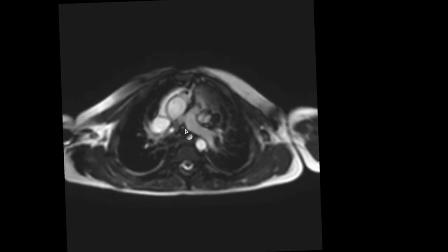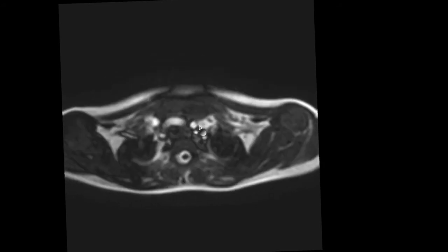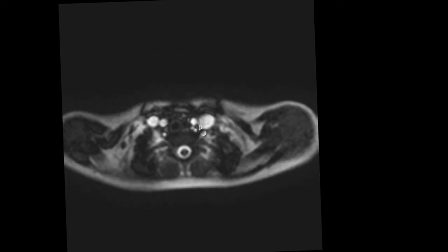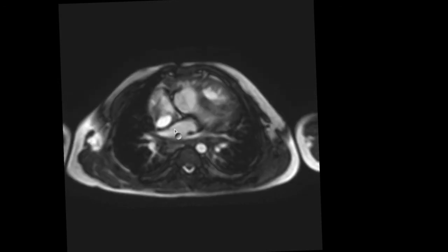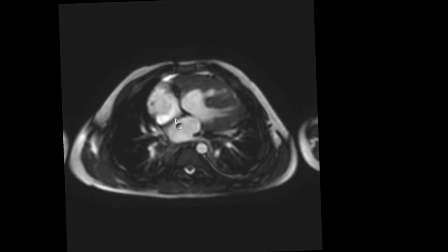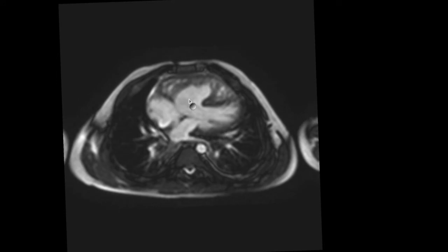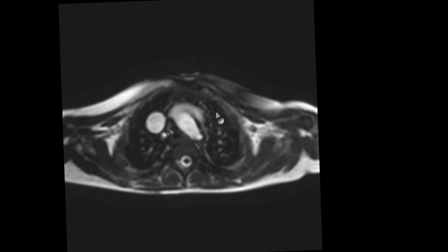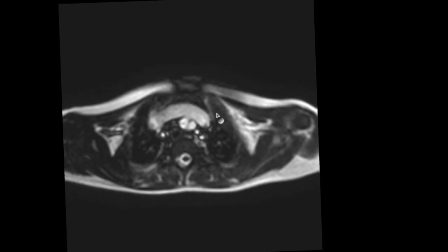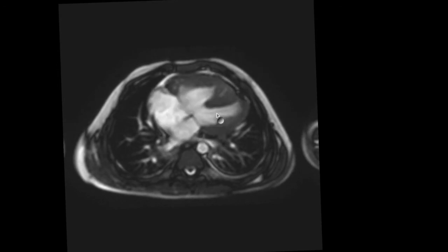Along with that, I am seeing a small vessel which is draining into the RPA, and if I follow it superiorly, it is coming from the subclavian artery. So it is a right modified BT shunt and it appears patent on these images. All pulmonary veins are draining into the left atrium. Left atrium drains into the left ventricle, and then the aorta arises from the left ventricle. Following the aorta, the aortic arch is left sided. Branching pattern is normal. On screening the aorta, there is no evidence of coarctation.